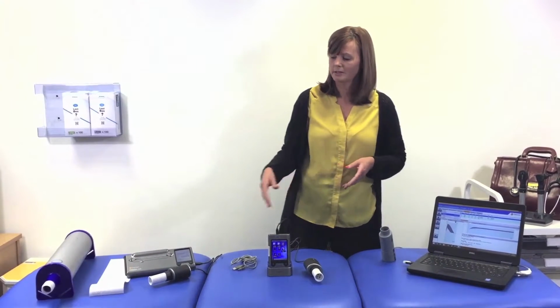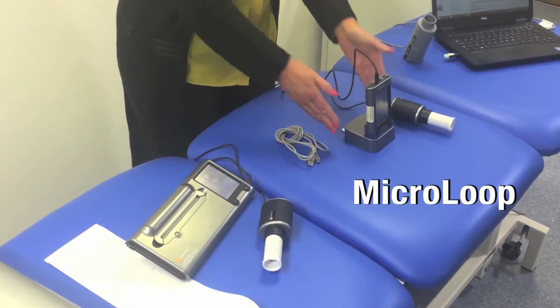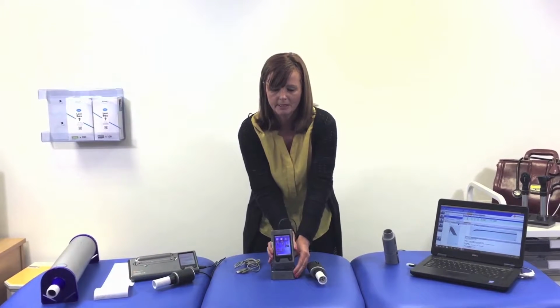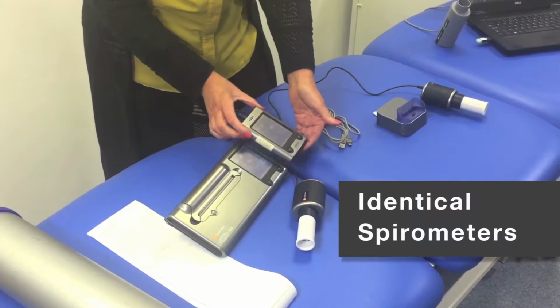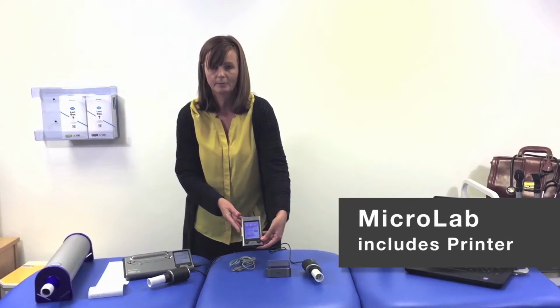I'll move on then to the standalone spirometers. So we have the Micro Loop and we have the Micro Lab. I'll just show you quickly. If I take the Micro Loop off its stand and I move it across, it is exactly the same spirometer as the Micro Lab. The Micro Lab has a printer, the Micro Loop doesn't.